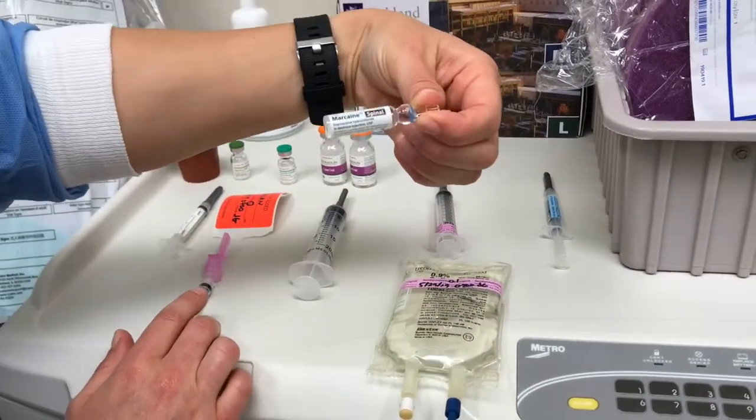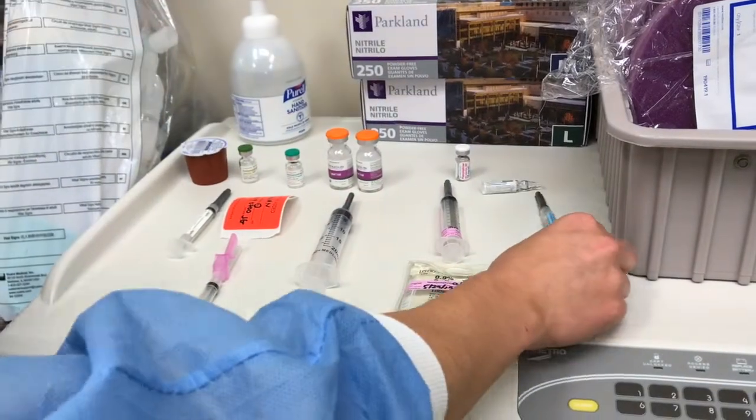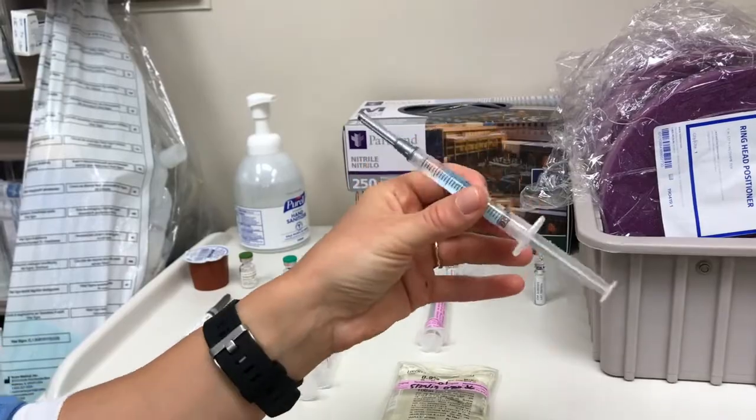Here's your 0.75 of Marcaine or bupivacaine. And then take out a 2 cc or 100 mic syringe of fentanyl.